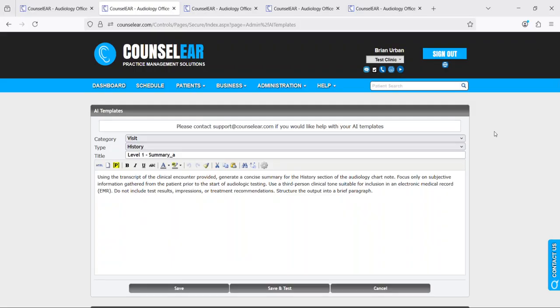All right, so that is the overview on the Counselor AI Assist process of activating the feature, utilizing it within the patient visit, as well as customizing templates within your account. Of course you have any questions, please give us a call, email us, live chat us. We are always happy to help.